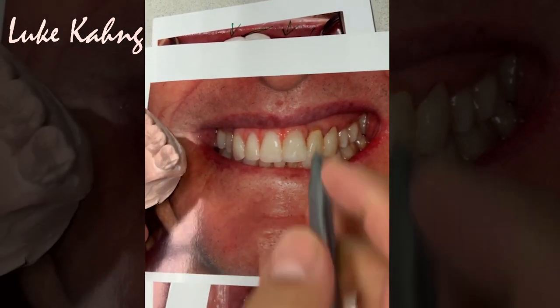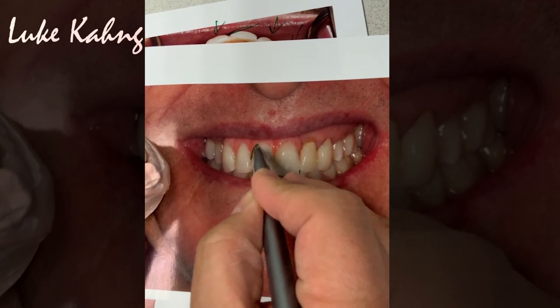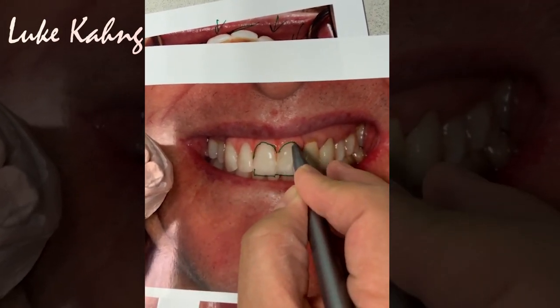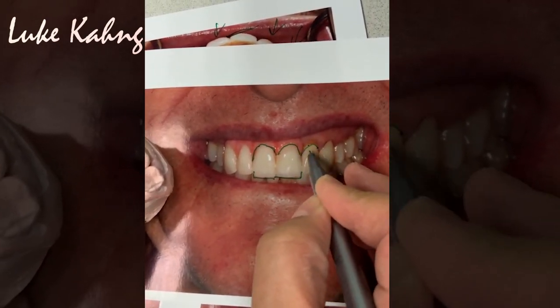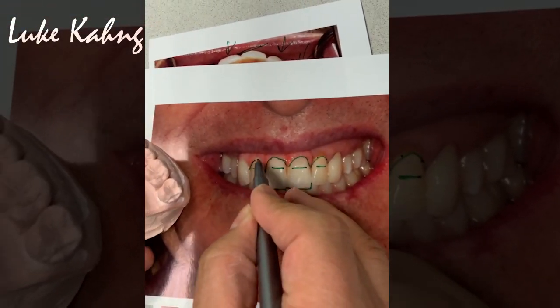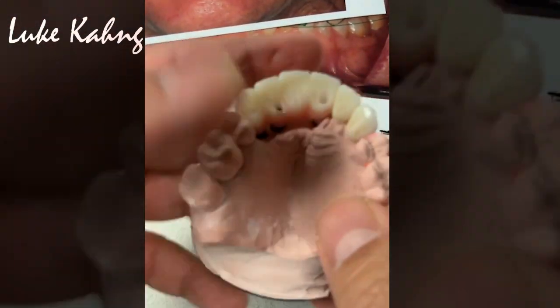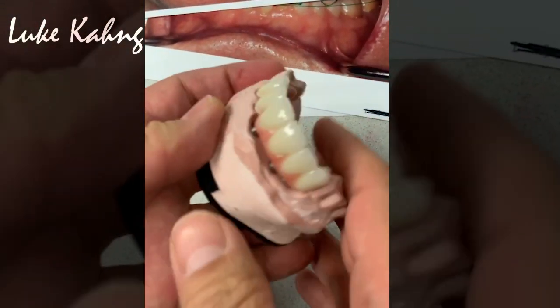Still, so we can change this. Change this, so make it a little bit more broad. The same thing, still broad, so golden proportion. All right, now, here it is, here we go. So we finish this. It's all monolithic.